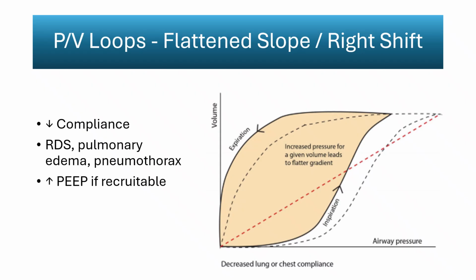Conditions such as surfactant deficiency, pulmonary edema, fibrosis, or evolving lung injury increase the elastic load. When elastic recoil is strong and the lung is difficult to expand, the volume gained at each step of pressure diminishes. The pressure-volume loop reflects this by stretching horizontally, showing that higher pressures are being used to achieve volumes that normally would occur at lower pressures.